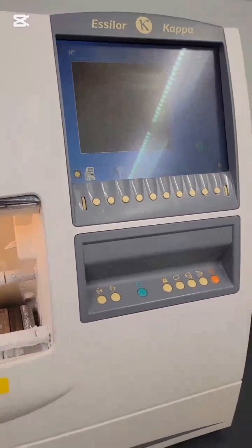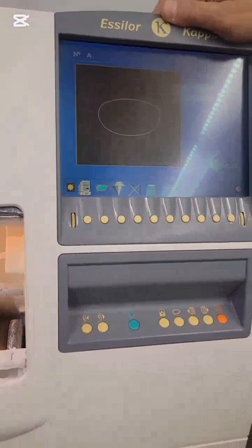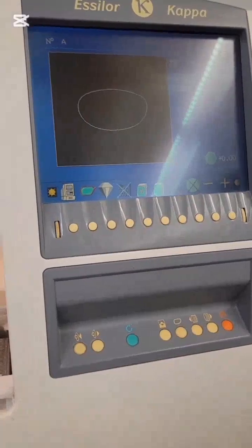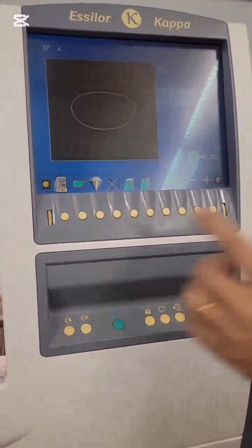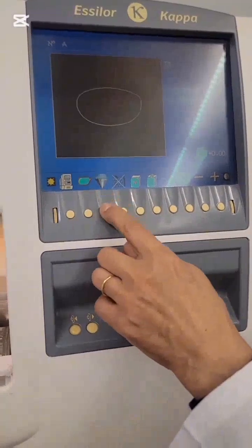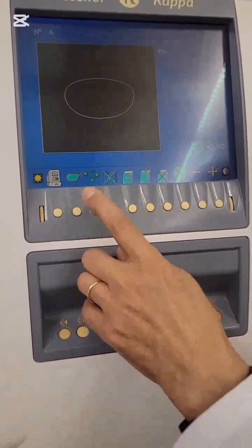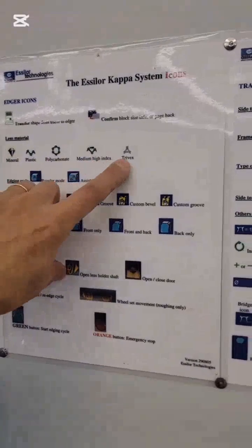Use this button to bring the information from tracer to the edger. On the screen, you will see the lens design and after a message to acknowledge the correct size of blocker. Use this button to change right or left lens. Use this button to change the material, which is glass or mineral, CR39, polycarbonate, and high index. There is always a chart which shows different material with their symbols.